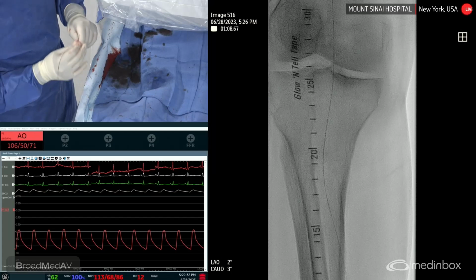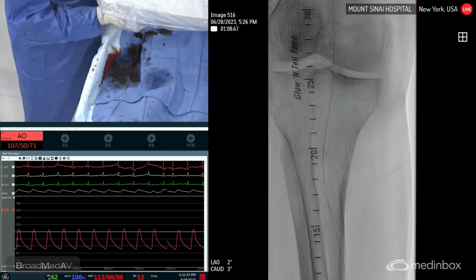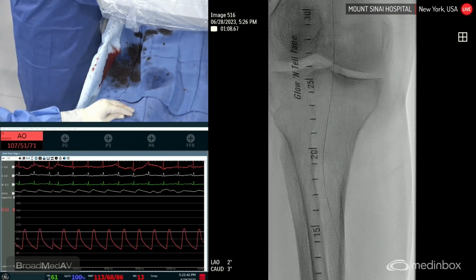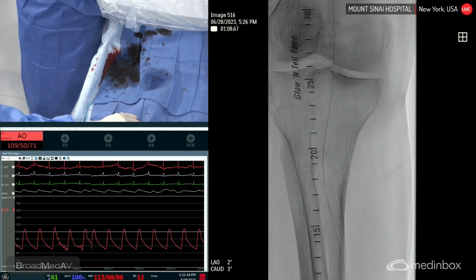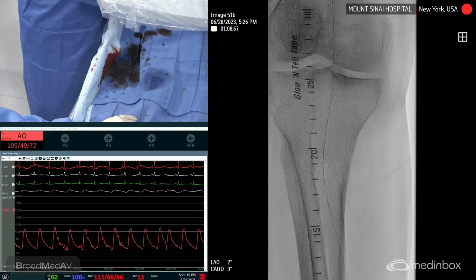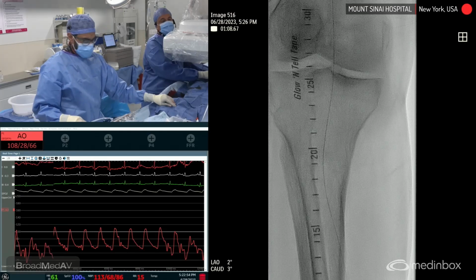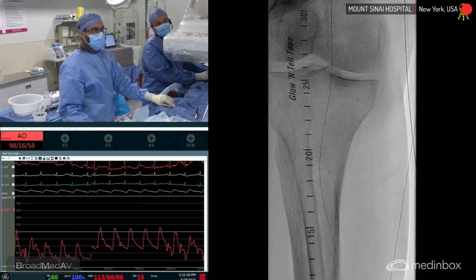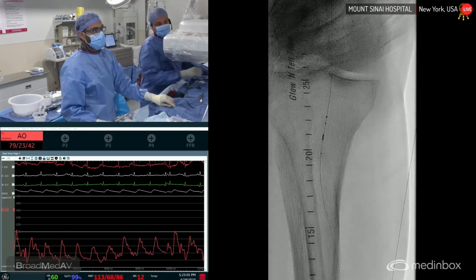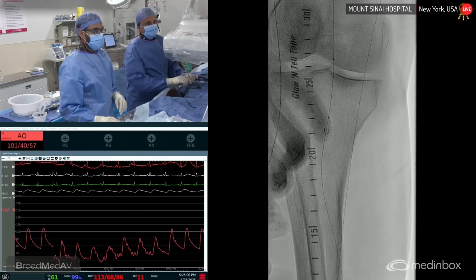The beauty of this is as you're doing these lesions, you don't have to worry so much about the filter moving and causing dissection. The disadvantage of this filter is that the capacity of the filter is less than the Spider. So if you're expecting large volume of thrombus or debris to come down, this may not be the filter to use. But the beauty of the filter is that it's independent of the wire. And because it's independent of the wire, you're able to move bulky devices back and forth without a problem. So I'm going to deploy it right about there, and it's very simple. It's just pull off the red tag and deploy the filter.